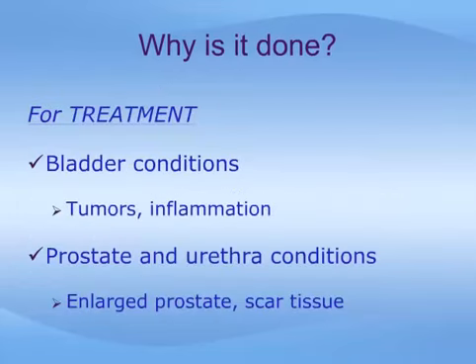Conditions that may be treated with the assistance of cystoscopy include bladder conditions, such as tumors or various types of inflammation, and prostate or urethra conditions, such as an enlarged prostate or scar tissue in the urethra.